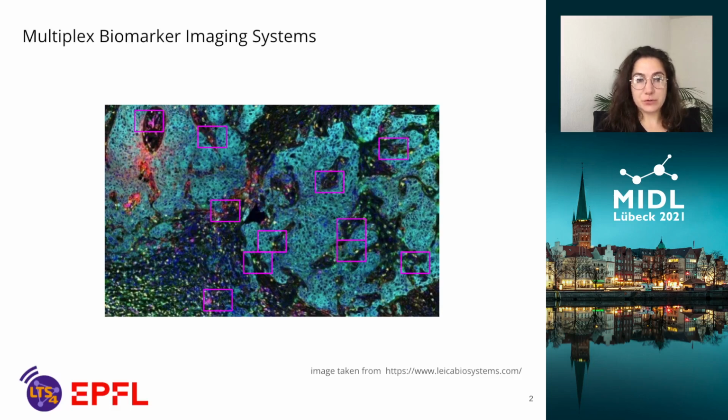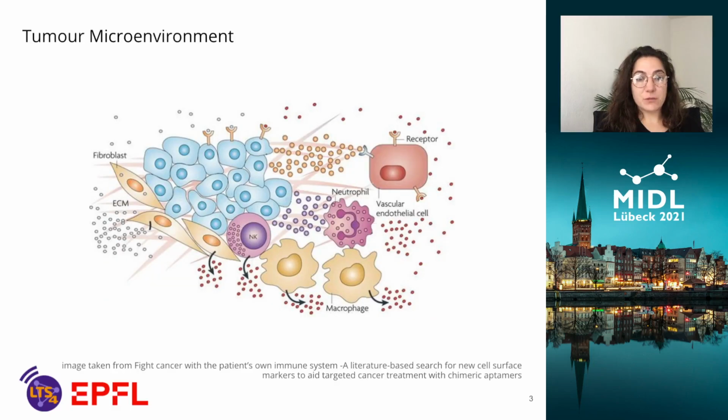Although very promising, this technology is relatively new, and labeled or even unlabeled datasets are very limited for data-driven approaches. On the other hand, it is now widely accepted that the tumor microenvironment carries valuable information for cancer prognosis and personalized medicine. The analysis based on spatial organization of different types of cells, as well as the interaction between them, is a very active research topic. Once segmented, we think that the inherent non-grid structure of cell locations makes graphs a perfect fit for such analysis. Defining each cell as a node based on cell location and constructing the graph based on spatial distances is a good starting point for using tools from network analysis for biomedical images.